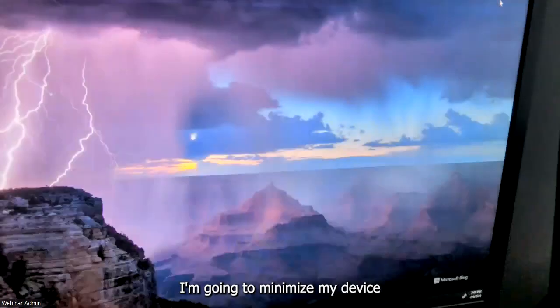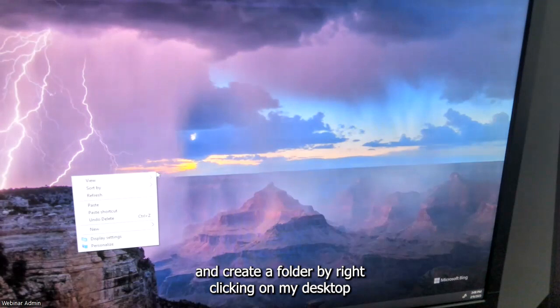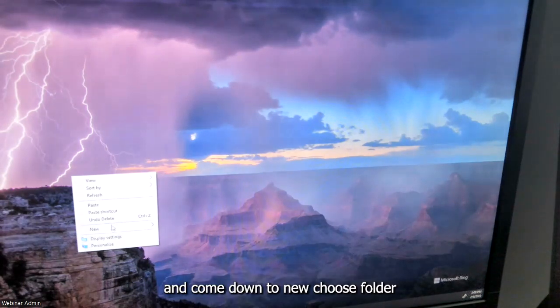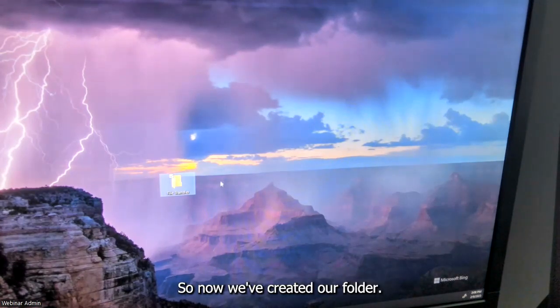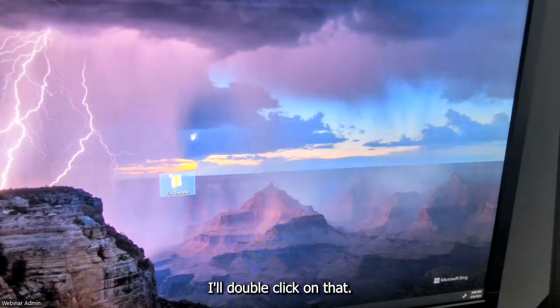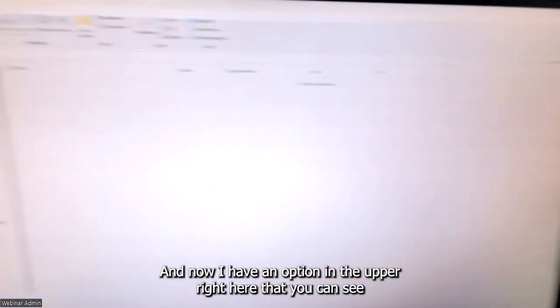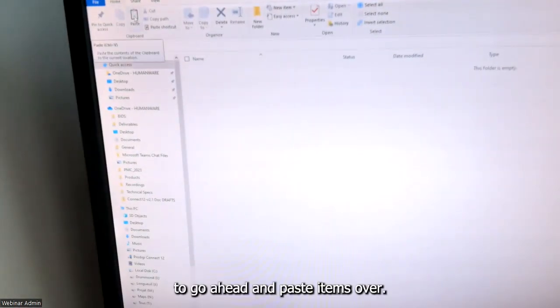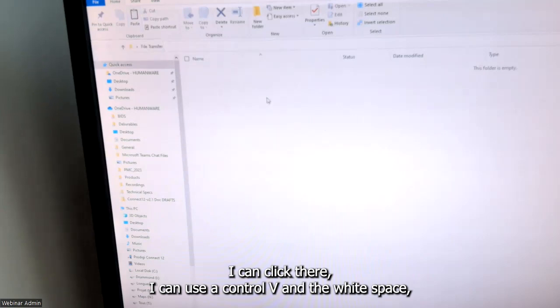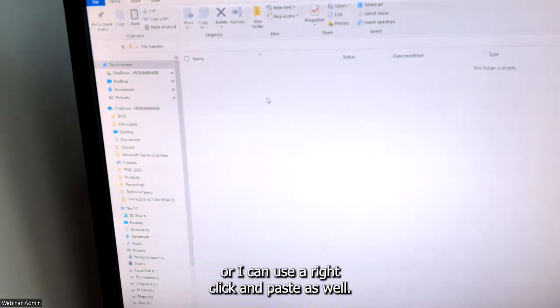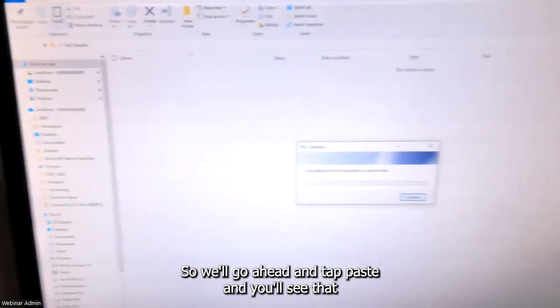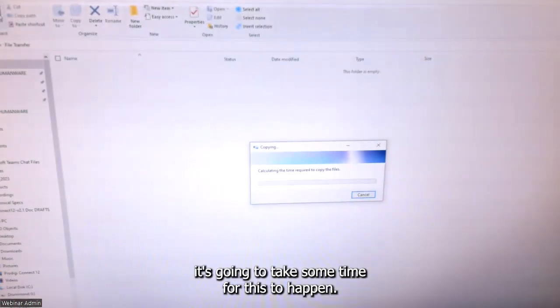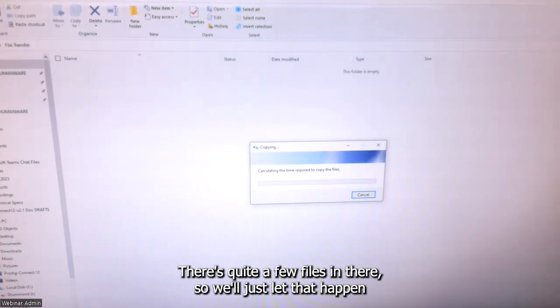I'm going to minimize my device and create a folder by right-clicking on my desktop, come down to New, choose Folder, and create this folder with the name "file transfer" — you can name it whatever you'd like. Now we've created our folder, I'll double click on that. I have an option in the upper right to paste items over. I can click there, use Control+V, or right-click and paste. So any of your copy-paste methods are going to work here. We'll go ahead and tap paste, and you'll see it's going to take some time — there are quite a few files in there.